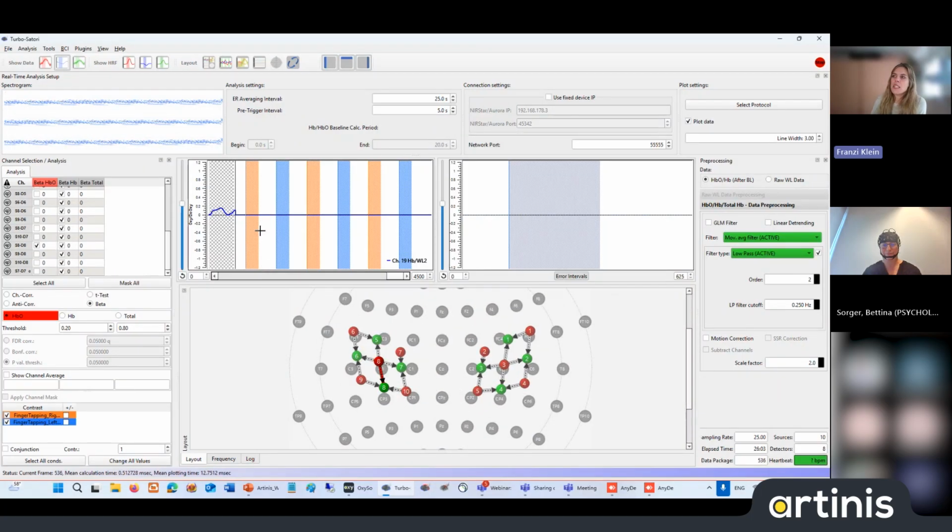And now, as soon as the signal arrives here in the orange phase, she will start right-hand finger tapping. Which she's doing now, exactly. So what we see here is the deoxygenated hemoglobin. The signal nicely decreases. Now she stopped tapping, and the signal increases again. So here on the right side, you see the signal for the first trial. Afterwards, we will see the block average signal.